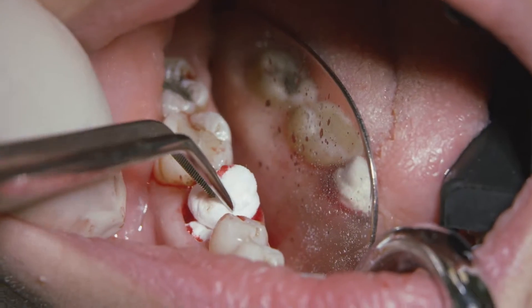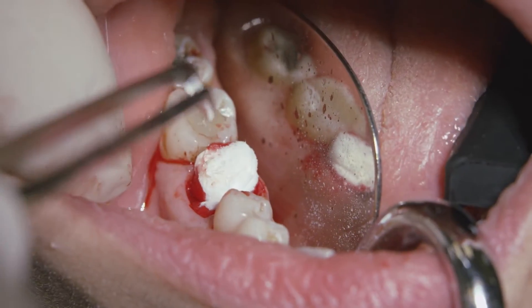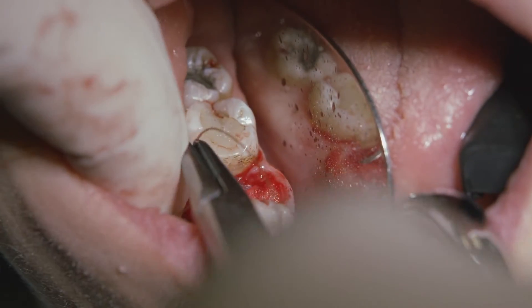On top of that, we should use a collagen plug. The function of the plug is to provide protection to the implant and the grafting material underneath, and also, after suturing, to allow healing of the soft tissue by secondary intention. Some clinicians prefer, instead of using the collagen plug, to make surgical maneuvers in order to stretch the soft tissue and achieve primary closure. This usually takes a lot of time and requires very good knowledge of surgical procedures.